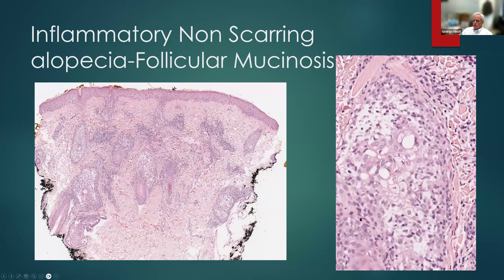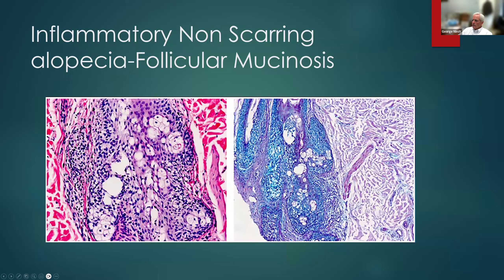Here's a case of follicular mucinosis. At low power, we see something that looks like spongiosis in the hair follicles — and at high power it still looks like spongiosis. But if we get a colloidal iron stain, we can see it's actually mucin, and therefore we call it alopecia mucinosa, or as a reaction pattern under the microscope, follicular mucinosis. I usually ask if the patient has a history or other stigmata of mycosis fungoides, since I would say more than half the cases we see are associated with that.